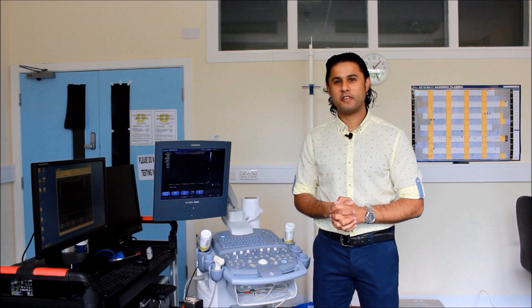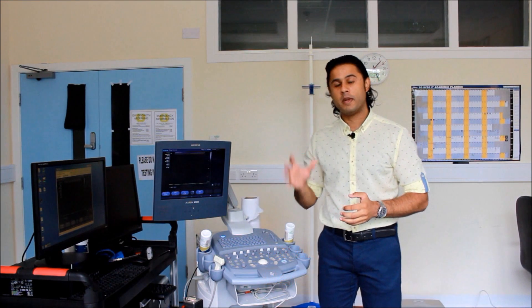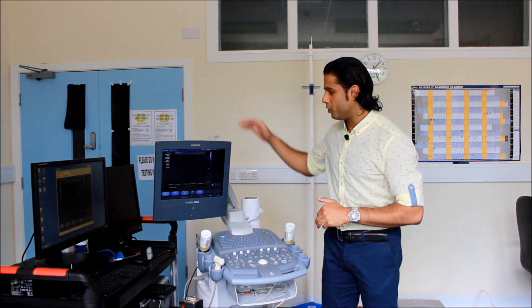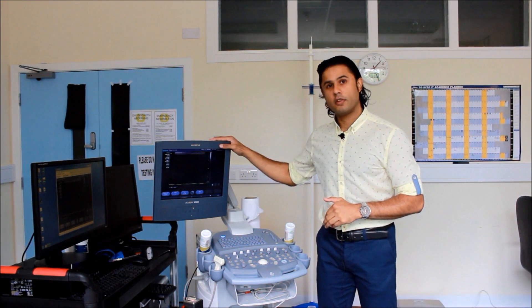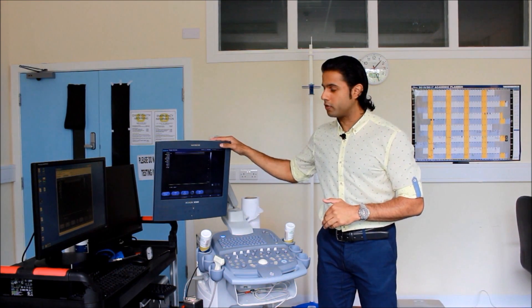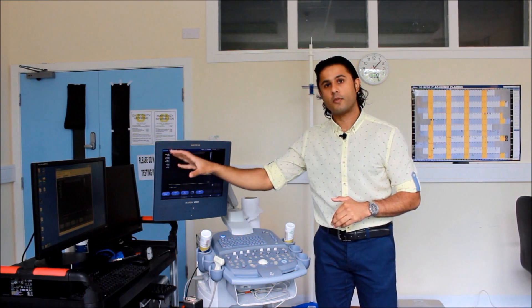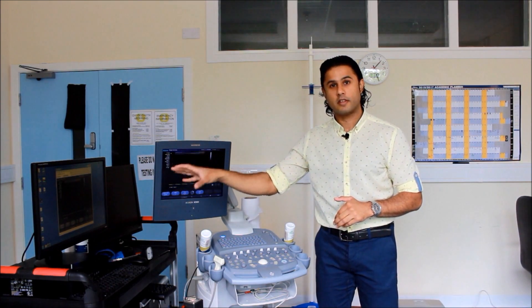Hello everybody and welcome to this edition of the Human Physiology video tutorials with me, Dr. Amir Sandhu. Today I'm going to go through the flow mediated dilatation technique using high resolution Doppler ultrasonography and specialist software to look at the vascular diameters.